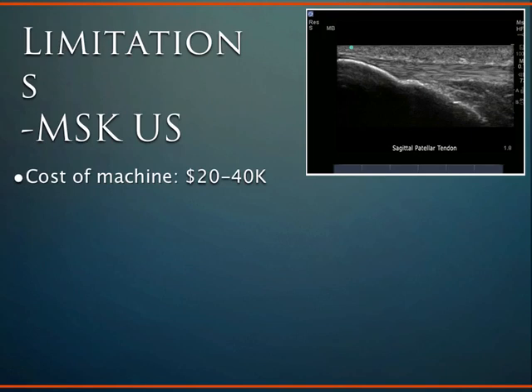In terms of limitations, though, it certainly can be expensive. These machines are not cheap, and if you're in a private practice or you're starting up a practice or even an academic situation, there is a significant investment to these machines. So there's a lot of front end costs, but in the end it can pay off in terms of the accessibility for the patient and accuracy of diagnosis and accuracy of procedures, injections. We'll talk a little bit more about that.